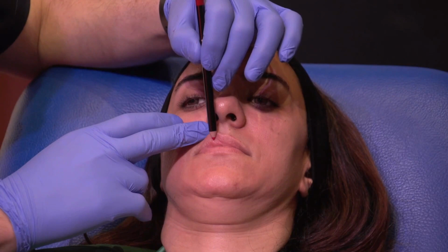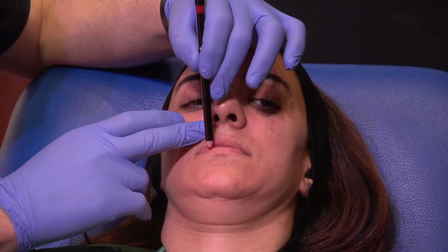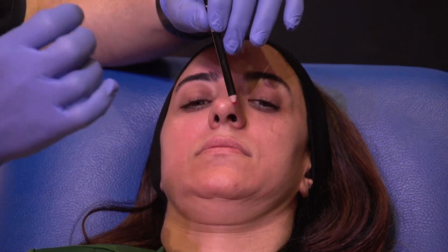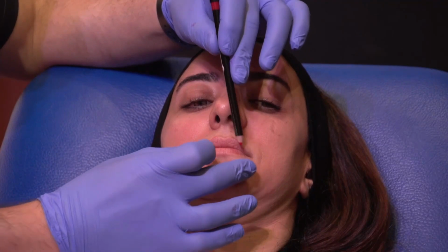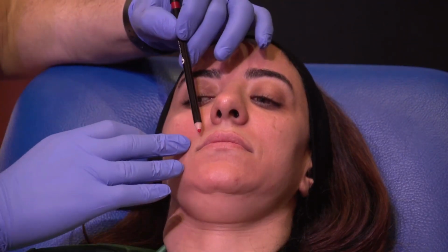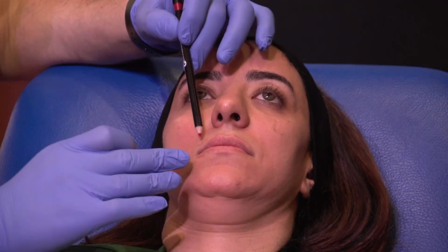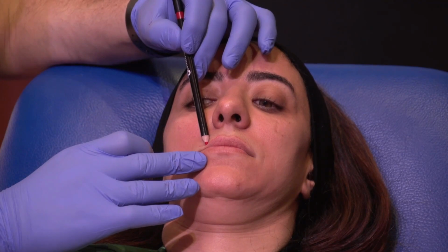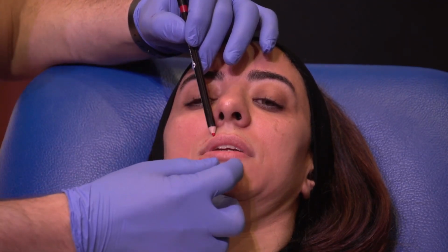Actually, it's not. But you augment the middle of the lip in this area and the lower lip where it's usually naturally augmented. You don't put any products on the lip laterally. If you need to, you might want to inject above and below the red lip, so in the white lip, to camouflage that and make it narrower on the sides. So imagine she'll have a fuller lip.